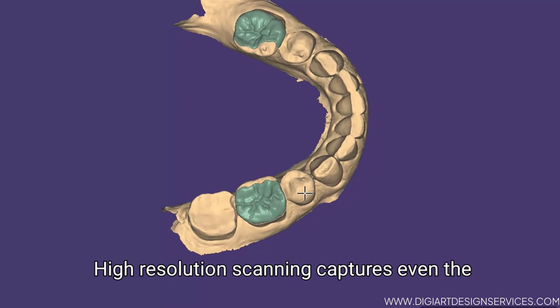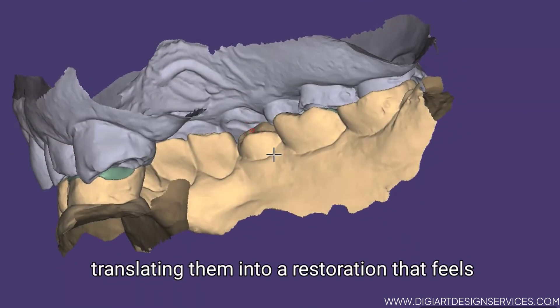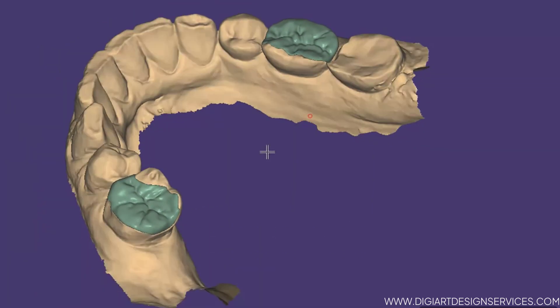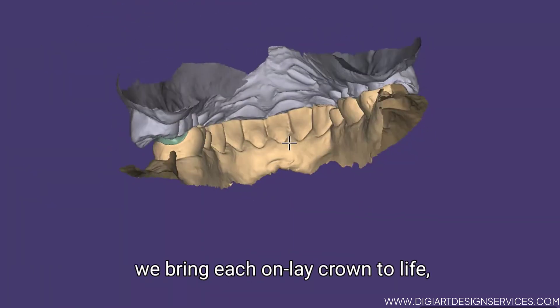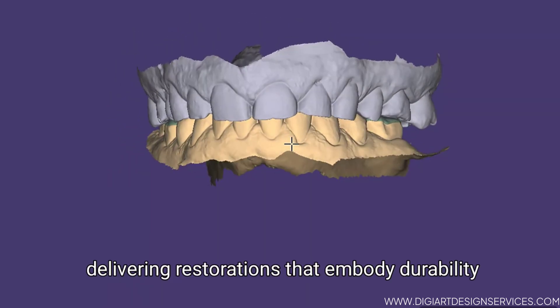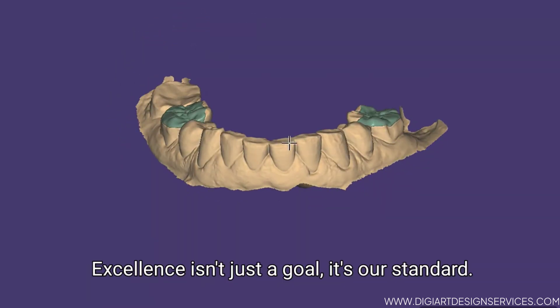High-resolution scanning captures even the finest details, translating them into a restoration that feels as natural as it looks. With expert hands and cutting-edge innovation, we bring each onlay crown to life, delivering restorations that embody durability, function and beauty. Excellence isn't just a goal — it's our standard.